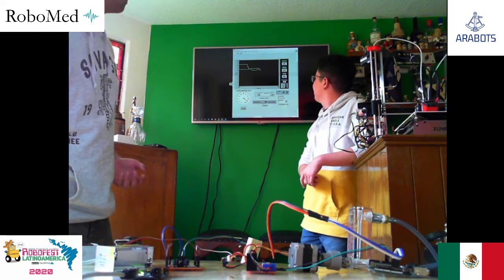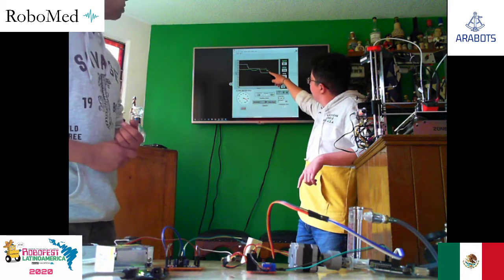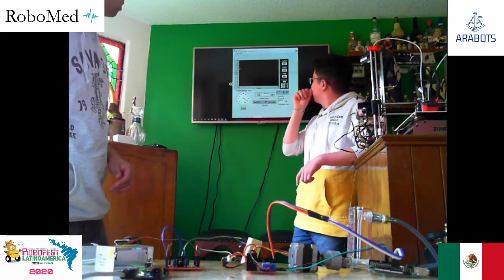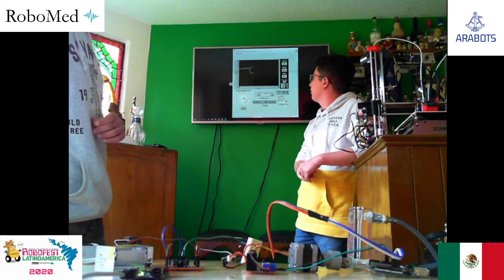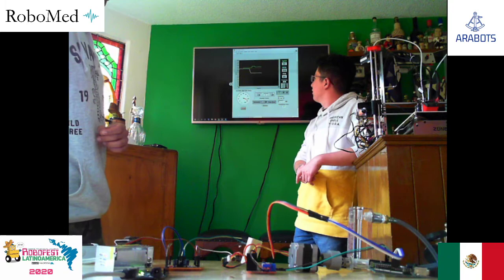Now, if the baby decreases his oxygen saturation, as you can see, the oxygen supply is increased by steps of 5%. And if the oxygen saturation is again near the standard, the oxygen supply can decrease again in steps of 5%.